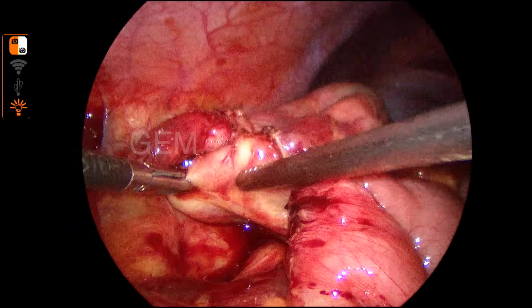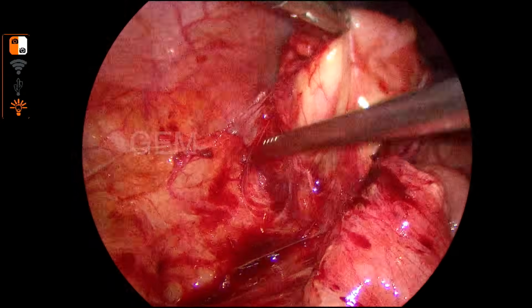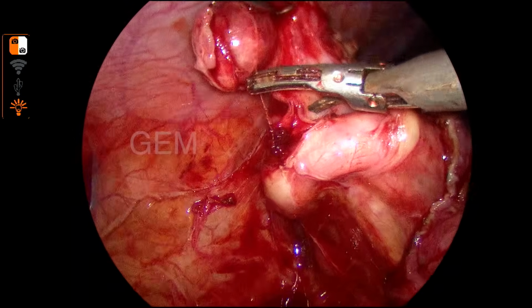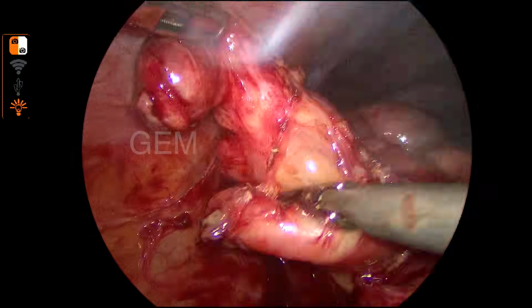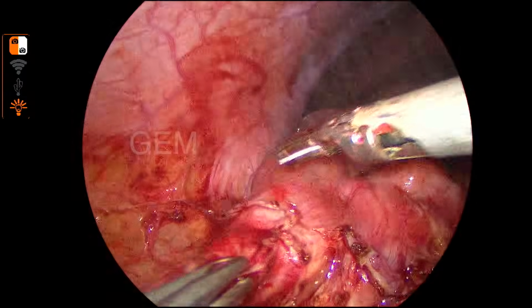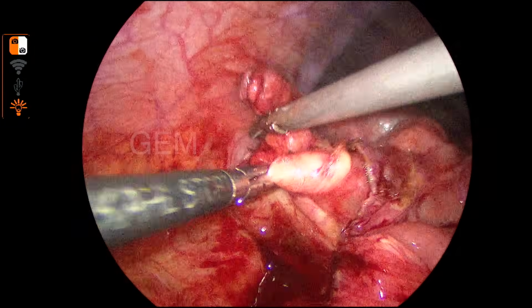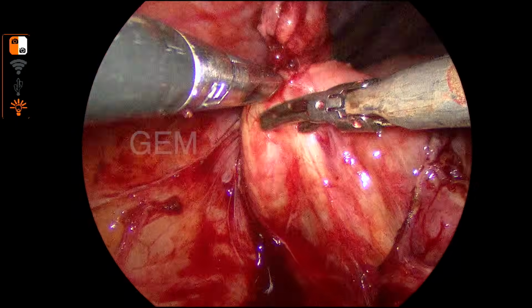So now I'm taking again posteriorly, and the entire part of ascending colon is also mobilized. So now if I pull, it is coming out. So it was actually facing on the retroperitoneal side, and now it is coming up. So now this job is easier, entire appendix is in my hand now. So I have to do dissection, divide the mesoappendix.